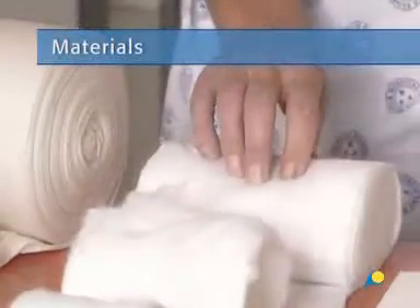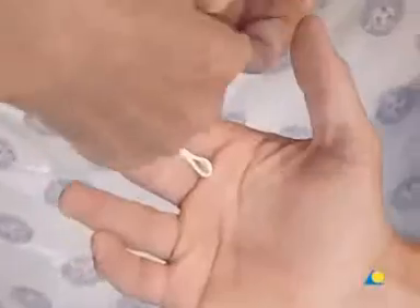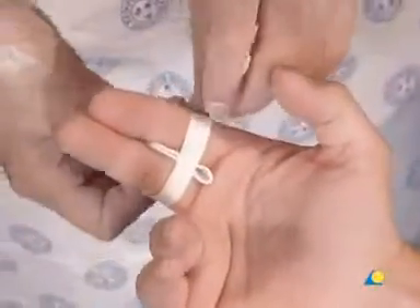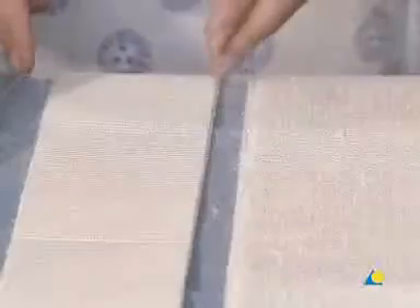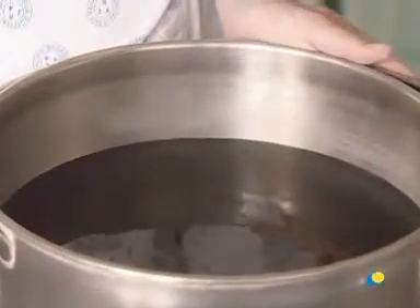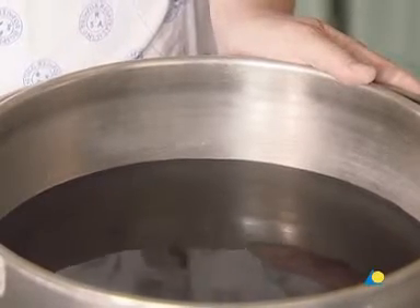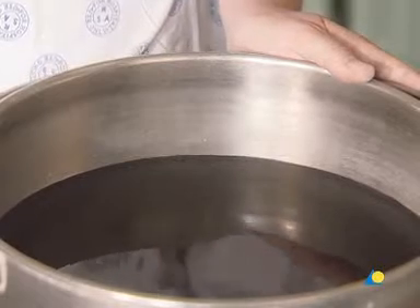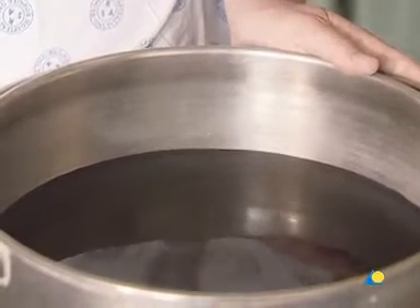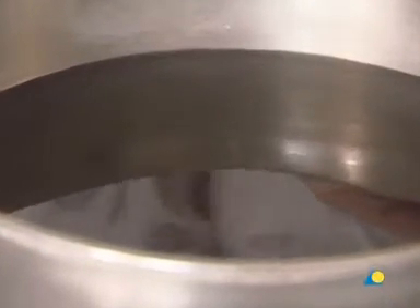To apply the radial gutter splint, the following materials are needed: cotton wool, which is used for undercast padding; surgical tape, used for buddy splinting; scissors; plaster slabs, which are generally five layers thick and available in differing widths; a crepe bandage to secure the plaster slabs; and water or another wetting agent. The water should be tepid or lukewarm, with an ideal temperature of between 22 and 25 degrees Celsius. Colder water or a wetter bandage allows for increased working time, while warmer water or a drier bandage reduces working time.